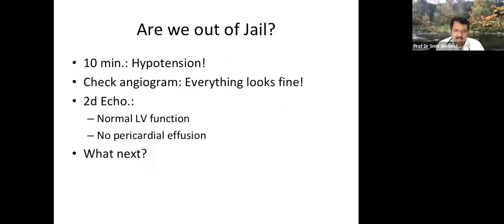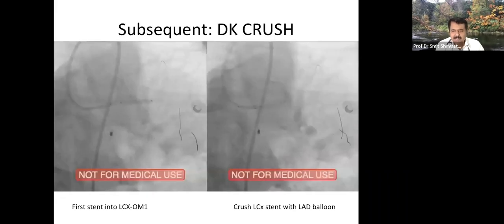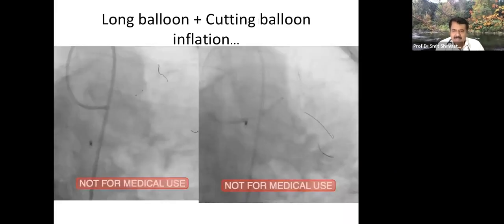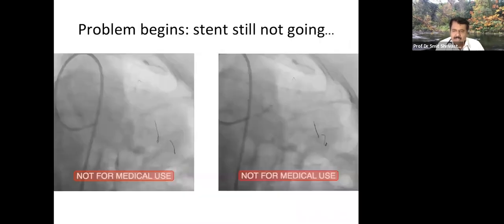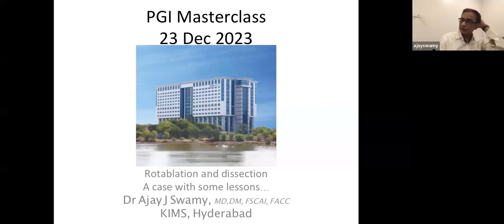Everything went well, but early this morning that patient had tachycardia. There was no pain in the legs, nothing, so I was wondering why he had tachycardia. Then he palpated the dorsalis pedis. It was absent, and he took him for ballooning. After ballooning, he had a dissection, and then he had a perforation. Ultimately, if you could have put a covered stent.